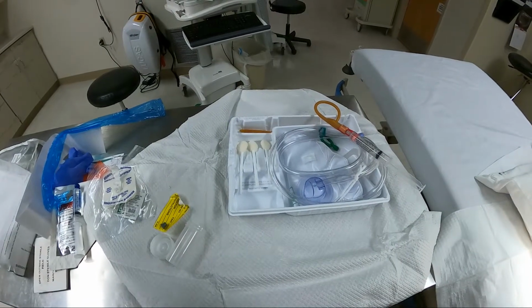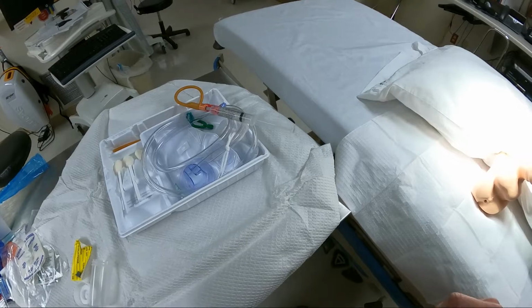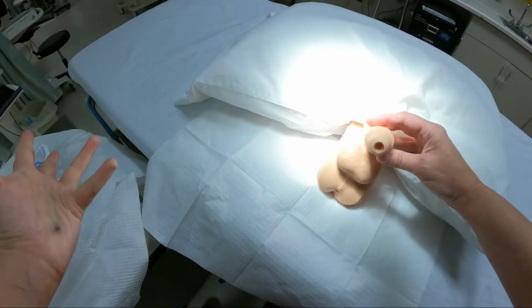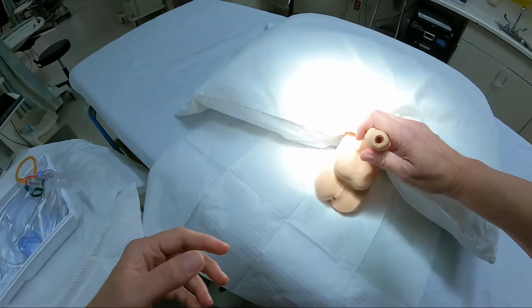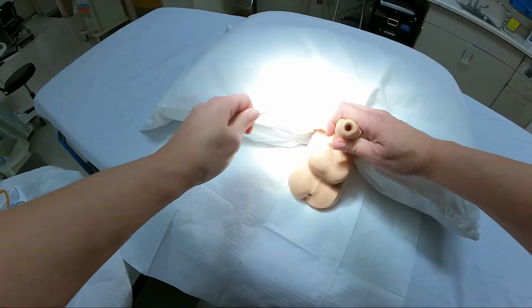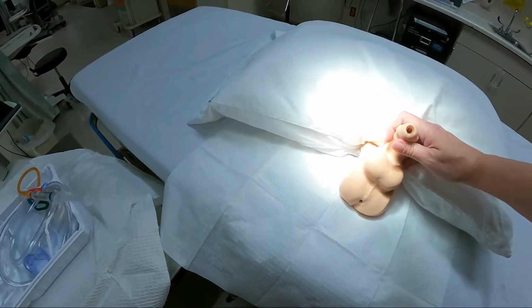Okay, a quick word about male catheterization. Pretty much we've reset back to the trays laid out, and we're getting ready to clean. Again, especially if they are not circumcised, you need to pull back the foreskin and clean that just like you were giving a bath, with a washcloth or with the bath packs. And you want to keep that foreskin retracted for the procedure. Now, again, make sure they're not allergic to iodine, then clean once, twice, three times.